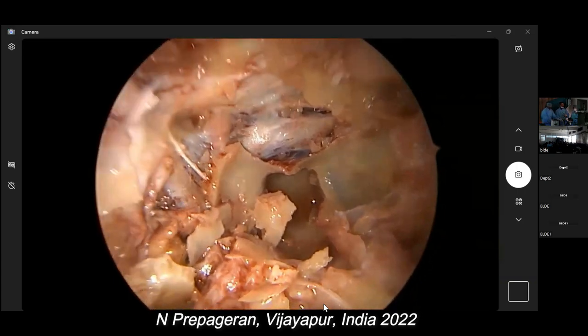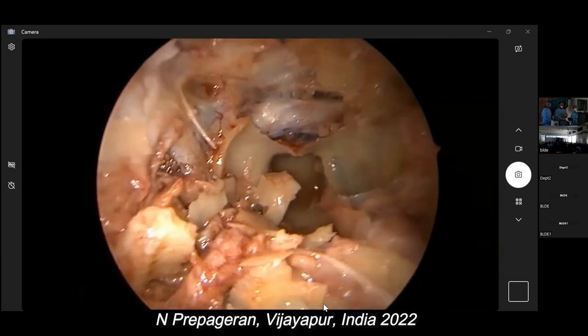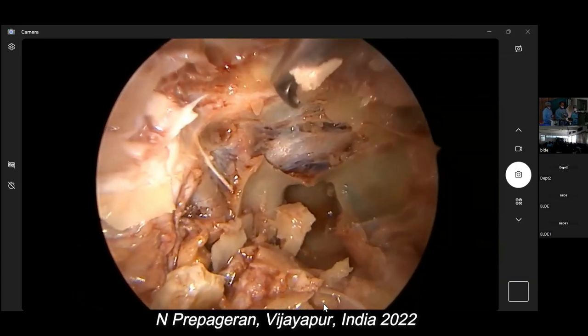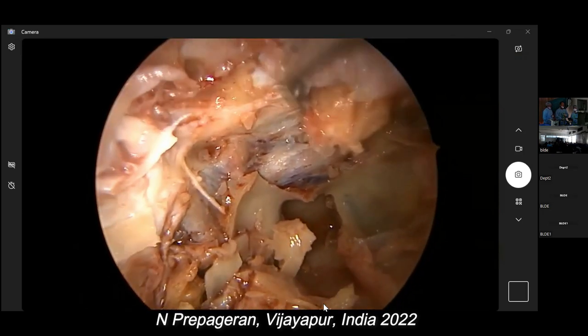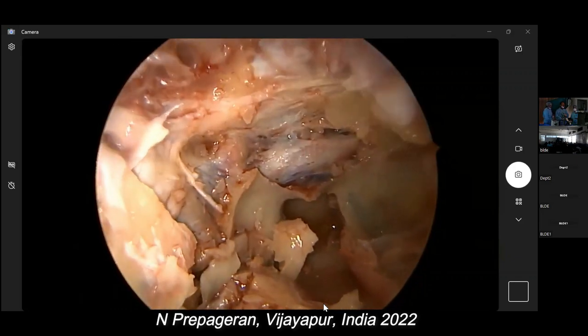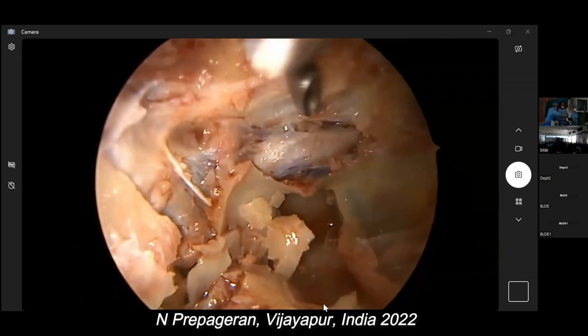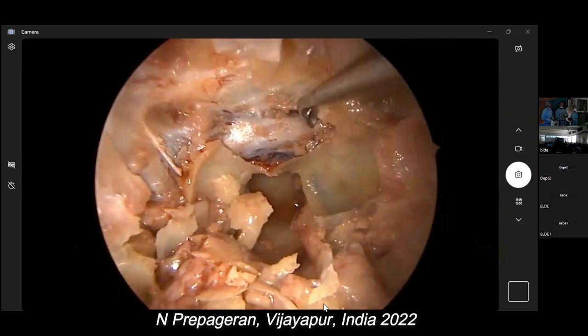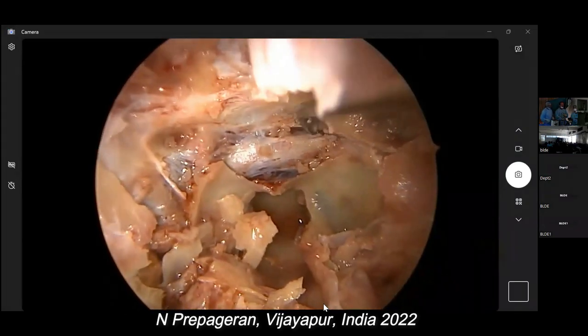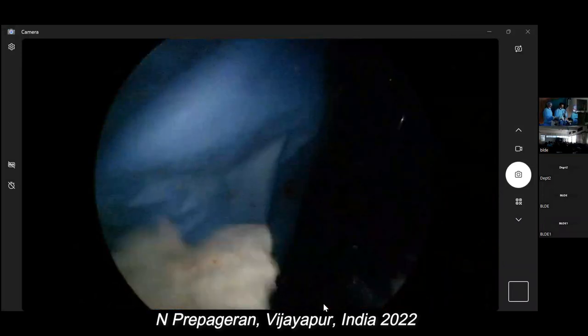So what we need to do now is see whether I can just flick the bone. Beautiful. Can you see, guys? You see how the bone comes out? And flick the bone, and flick the bone. You see, I keep my scope very far, so that I don't hit the scope.